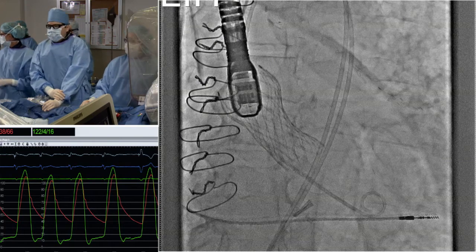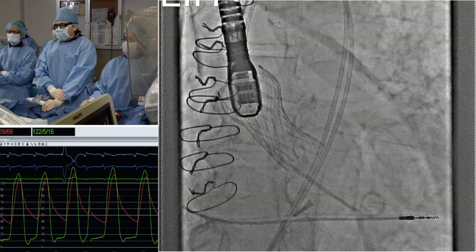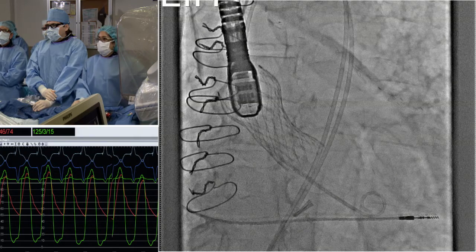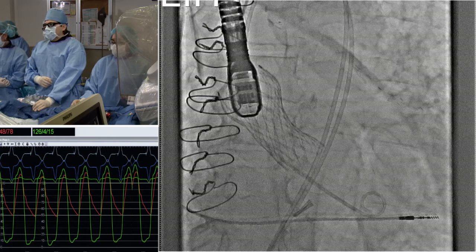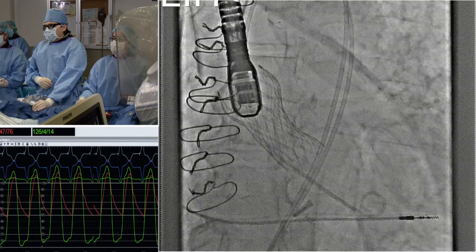So I take your point, Nick, and I agree. I think hemodynamically the AI doesn't seem that significant yet. We're still waiting. The EDP hasn't really budged. I guess what's bothering me is also that gradient that we still have of 13 and seeing that it's obviously constrained at the annulus. So my vote would really be to post-dilate it. So we're going to verify our pacemaker and we are going to post-dilate this.